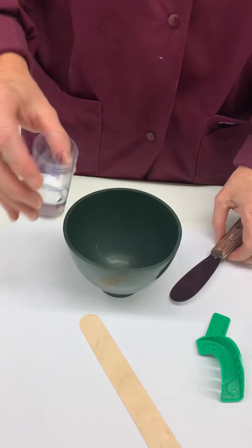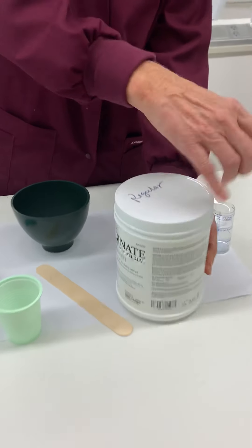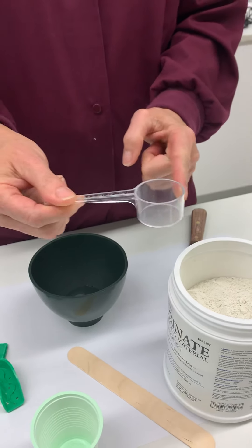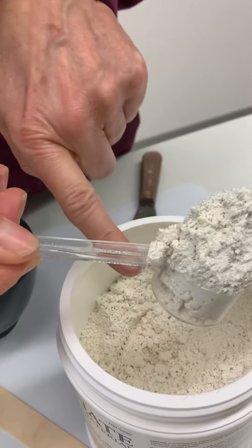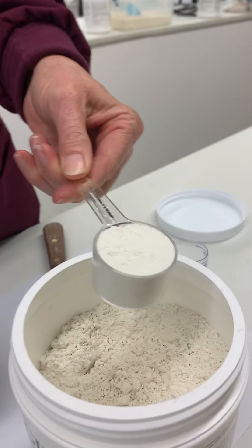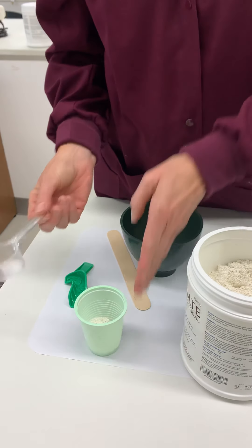First, we're going to take our water and put it into our bowl. Now we're going to measure out our alginate. Here is our alginate powder, all fluffed up, and here is our alginate measuring scoop. We scoop it up, alleviate any air pockets, carefully tap it a few times, level it off, and put it into our cup — making sure it's not the water cup.